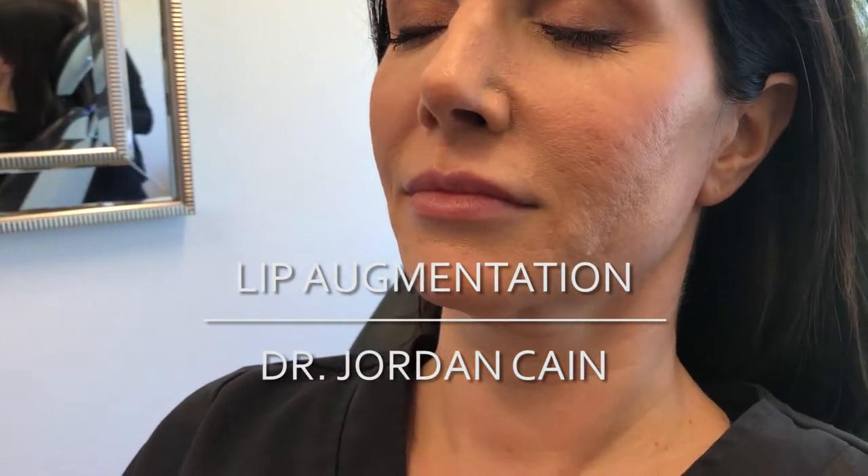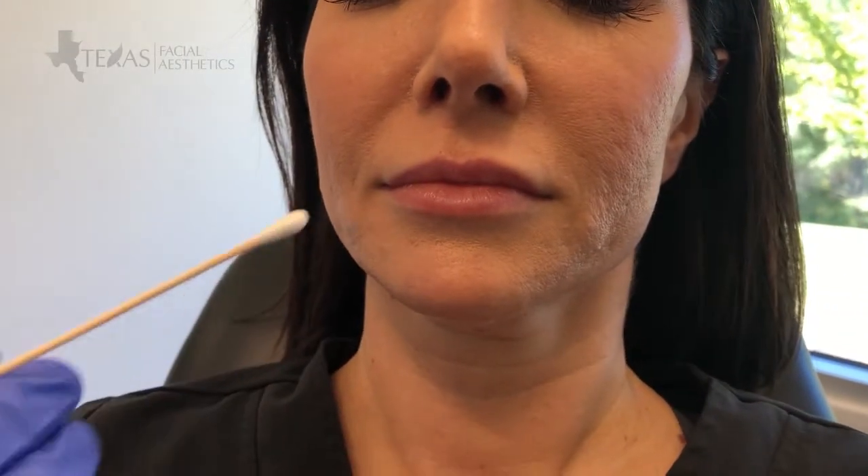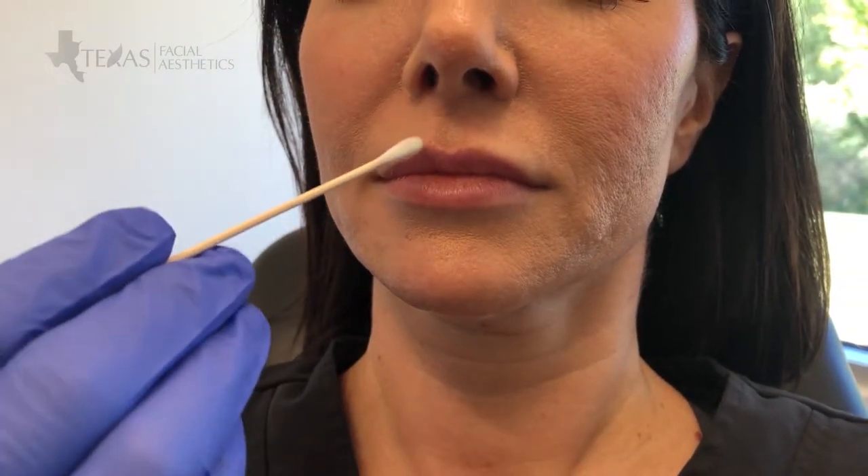Alright, so we're going to be doing some lip filler today. As you can see, this patient already has a pretty good definition of the lips but wanted to add a little bit more volume and just smooth out some of the fine lines on the lips and just around the lips.